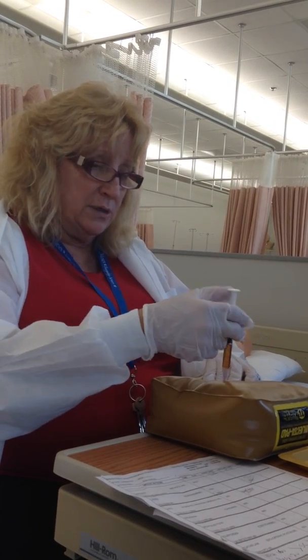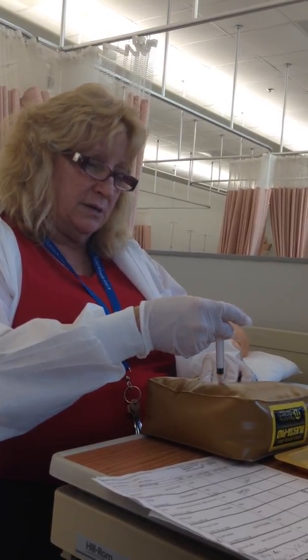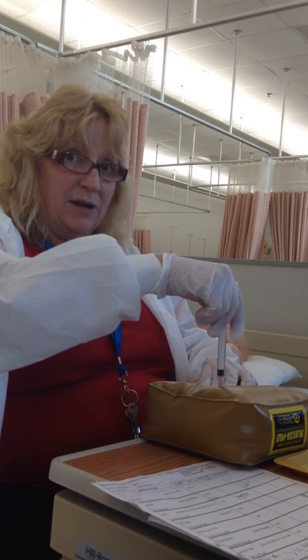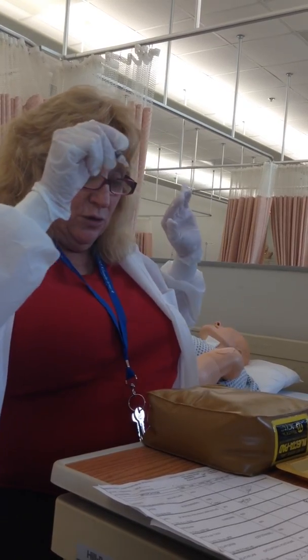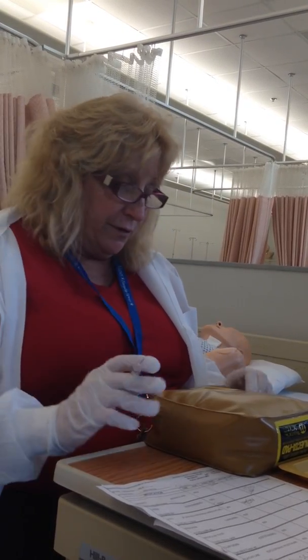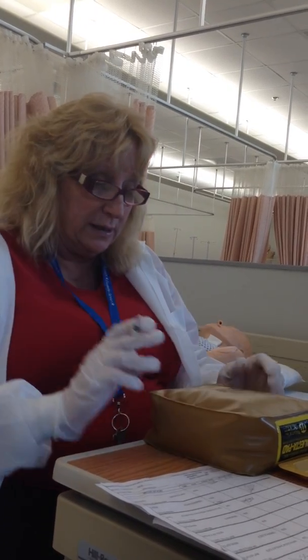So now I'm going to go ahead and inject. And I'm going to count to 10. 1, 2, 3, 4, 5, 6, 7, 8, 9, 10. I slid my hands down here so I can have better control than trying to take it out like this. You might drop the syringe and prick the patient. You count to 10, you take this out and you release it, and it's sealed over. At the same time as you're taking out the needle, you release. Yes, and it goes over and it quickly seals it.